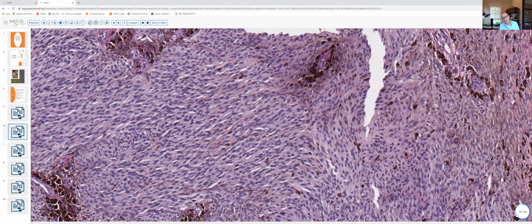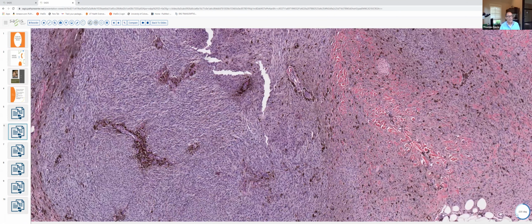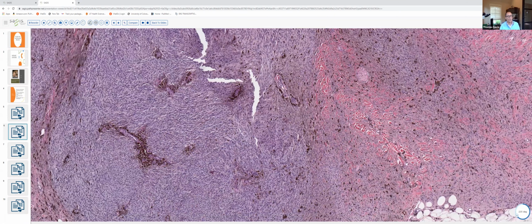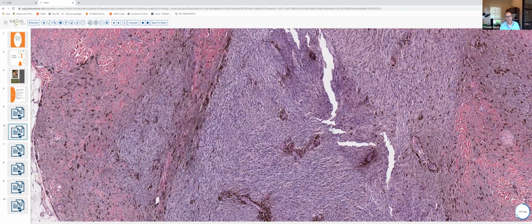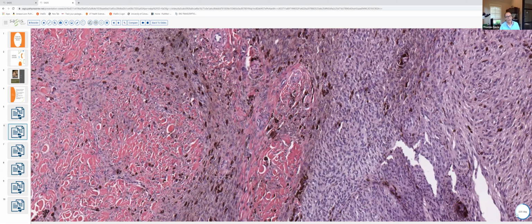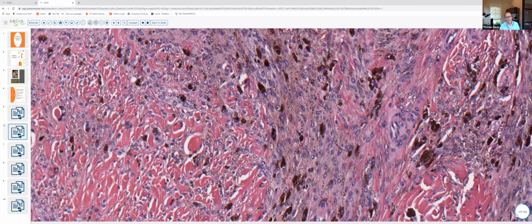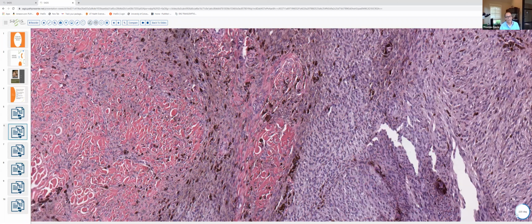Within the surrounding stroma, there are melanophages. But what's characteristic of a cellular blue nevus is that surrounding these lighter staining areas, there are zones of fibrosis, which we can see out here, containing melanophages and pigmented dendritic cells and spindled melanocytes. So again, this biphasic pattern is very characteristic.